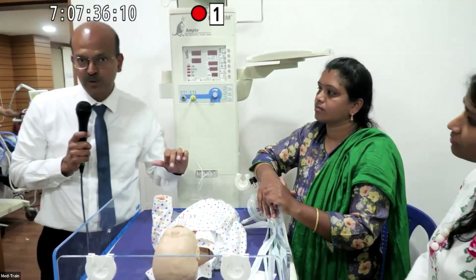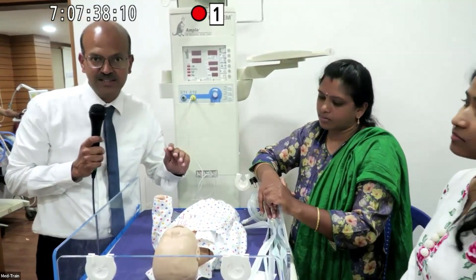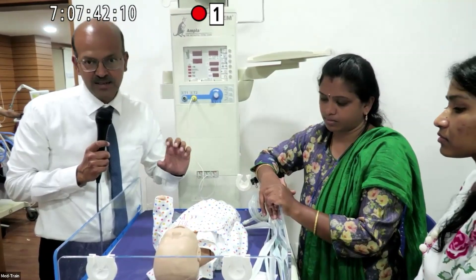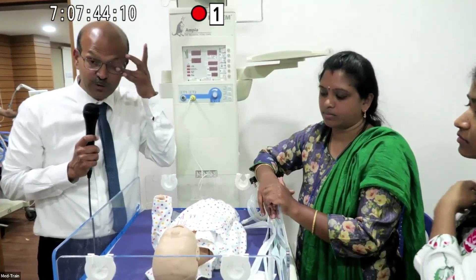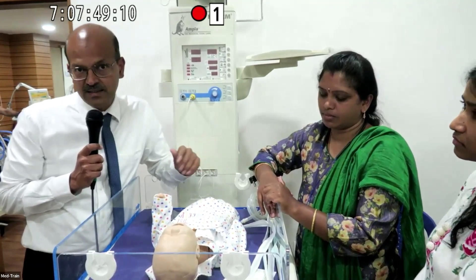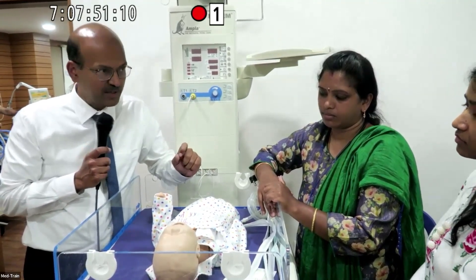If you decide to use inline suctioning, get the company to come and demonstrate to your staff, as inline suctioning is not easy to learn without hands-on practice. Cost is a factor, but for very sick babies — especially those on high-frequency ventilation — consider using inline suction.